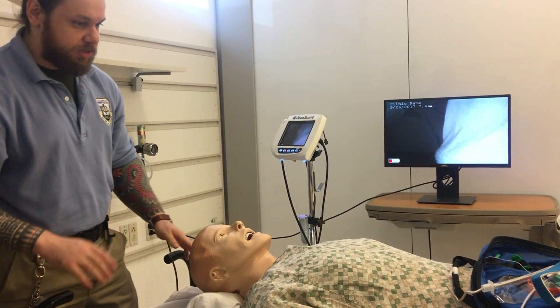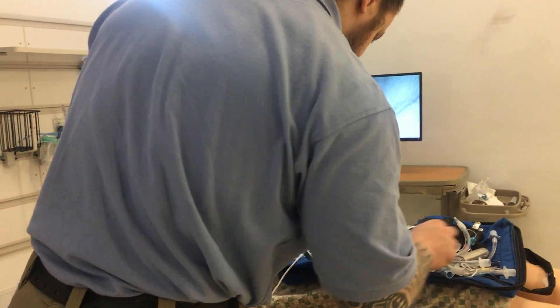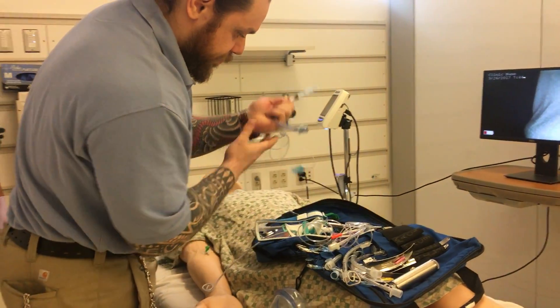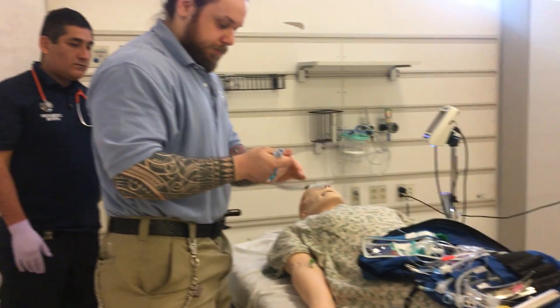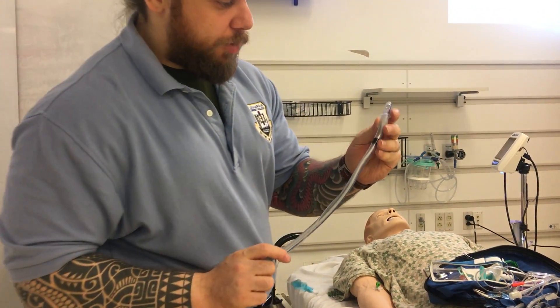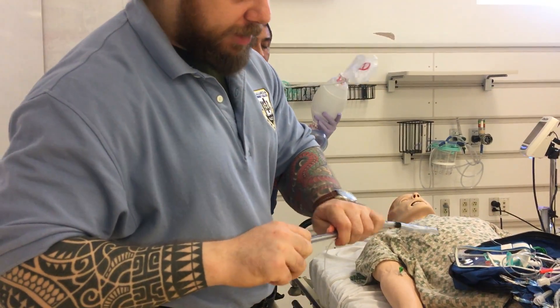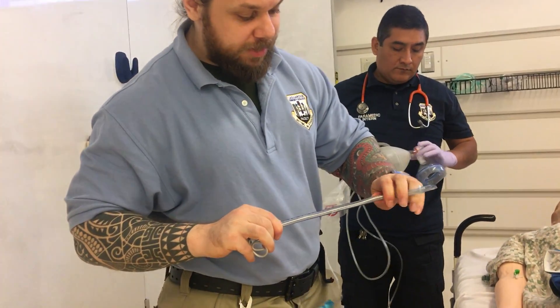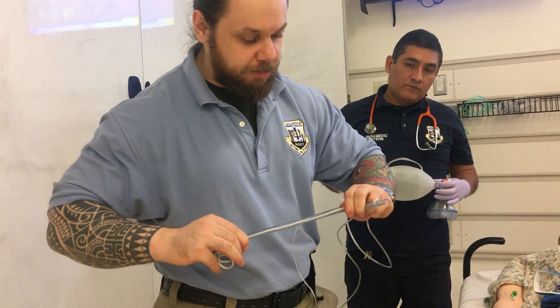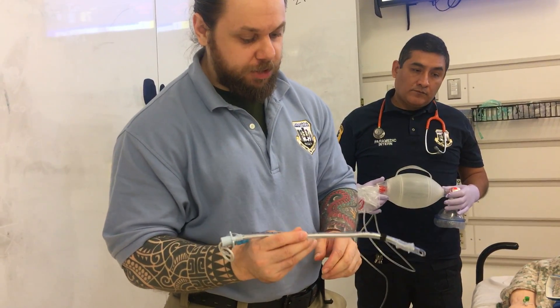Now I want to talk about how to adjust the endotracheal tube to insert it properly. Take a 7.5 tube and a stylet — make sure the stylet is not past the Murphy's eye. Then I like to put it in a hockey stick position: straight to the cuff and then bent like a hockey stick. This shape gives you much easier maneuverability — if the airway is anterior you can twist it up, if it's posterior you can twist it down.